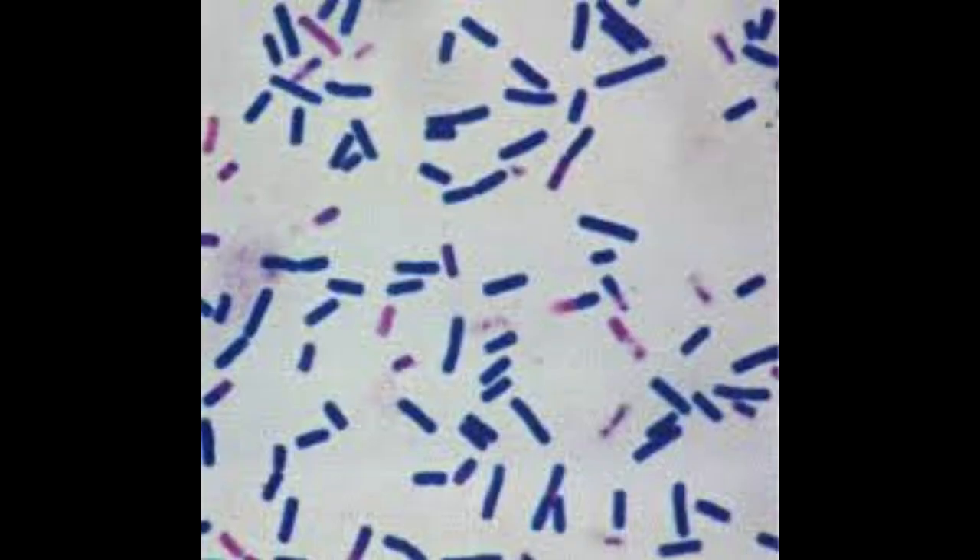Cocci tend to be quite easily treated with a lot of different antibiotics. If I see rods, it's a whole different story. Rods can be things like Pseudomonas, which is known to be quite resistant to a lot of antibiotics. Or very rarely, E. coli. Rods, compared to cocci and Malassezia, are known to be resistant to quite a lot of different antibiotics.